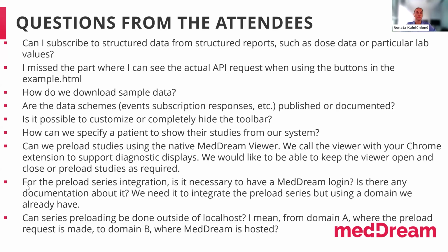Okay, so I can move to the next question, yes? Yeah, in principle, theoretically, even from a Chrome extension plugin, via the communication API, you can open a study, preload it in browser memory, and then unhide it. So theoretically, it should be possible. We never tried this.